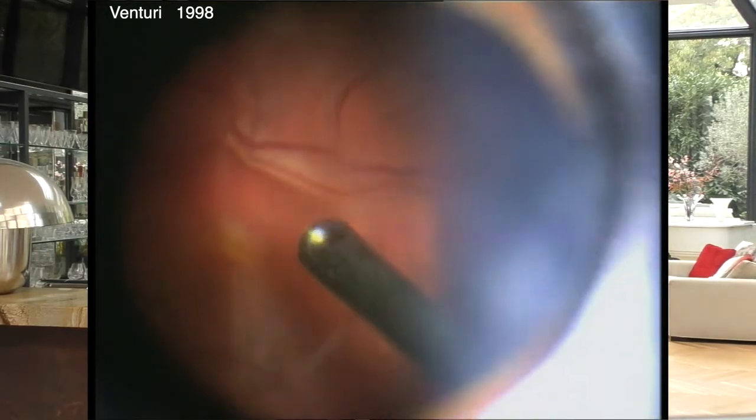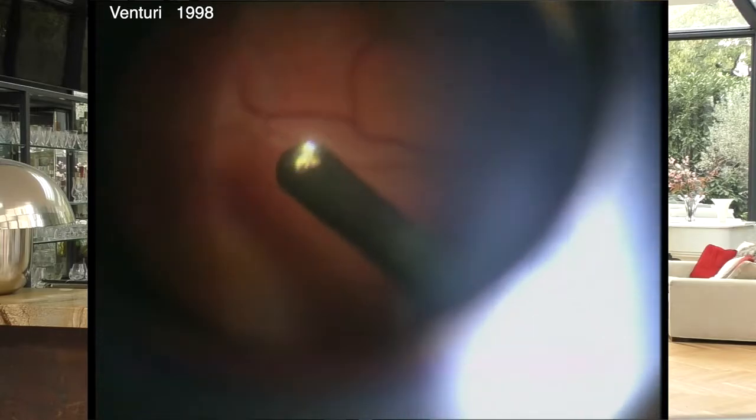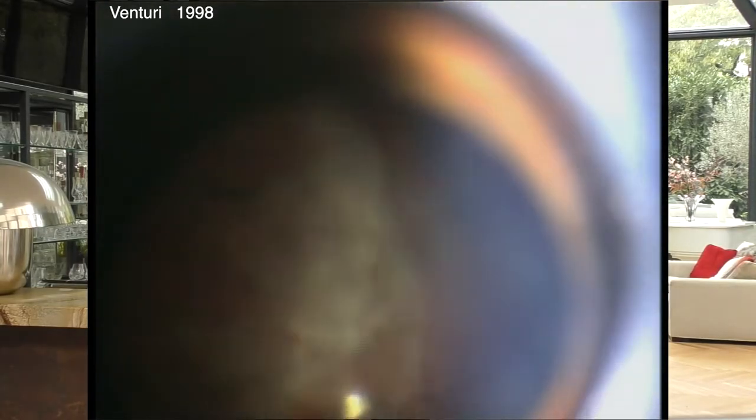And this is exactly the accident that happened to me and that I showed in the previous chapter, when in a third of a second I bit the retina. With a venturi pump, the handpiece then becomes dangerous because it does not allow you to control the progression of the vitreous as the volumetric pump does. The operator cannot choose his cutting frequency anymore. He will be forced to opt for high-speed cutting, even if this goes against all his everyday gestures.